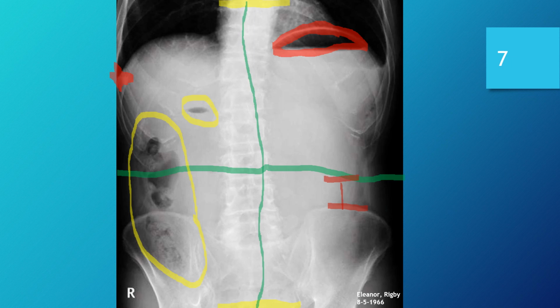The spinal column's present, but not in great detail, and this is really kind of a high contrast situation. So it leads me to believe that perhaps we were dealing with a lower kVp than we would typically use for a belly, and perhaps even a lower mAs, because in the central areas it's definitely very diffuse as far as the contrast is concerned.